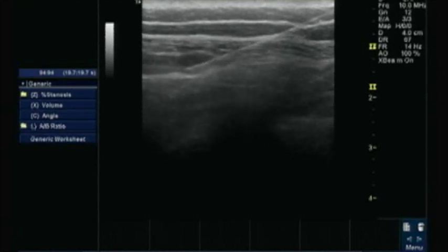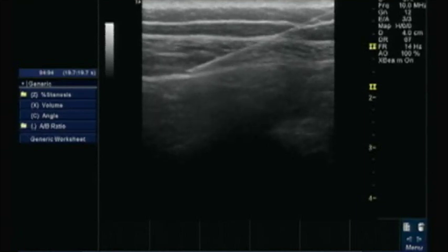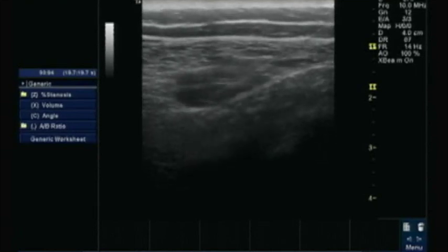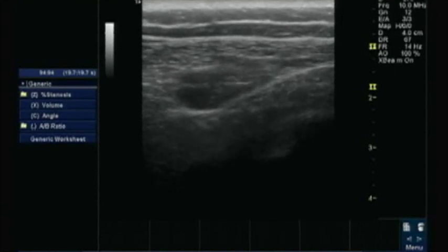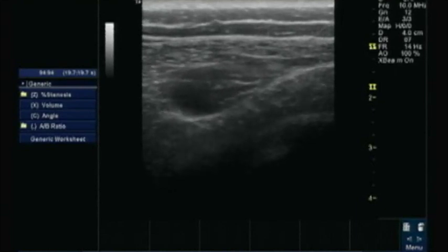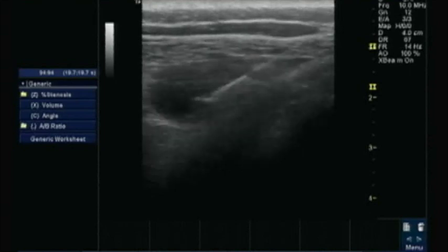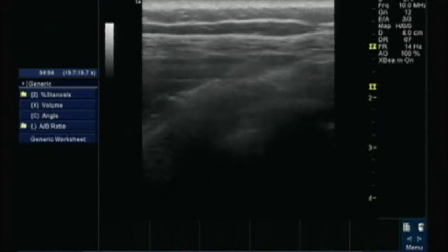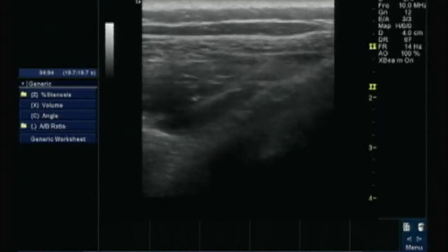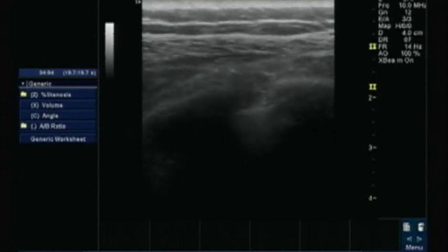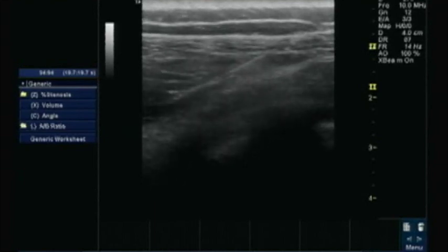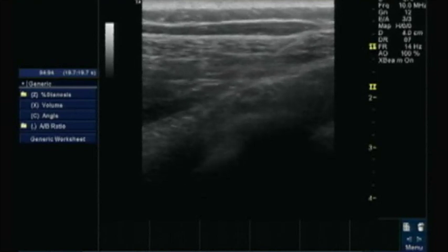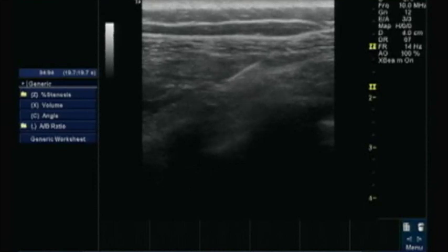This drug will spread in a very large plane and it will block the lateral branches of the intercostal nerves. Here you can see I am dissecting the plane and the needle is visible nicely — the drug is spreading nicely in the plane. I will inject at least 20 ml of local anesthetic, sometimes 25 ml of ropivacaine 0.2%, and it will nicely spread in the plane between latissimus dorsi and serratus anterior, providing excellent analgesia in the post-operative period for breast surgery.